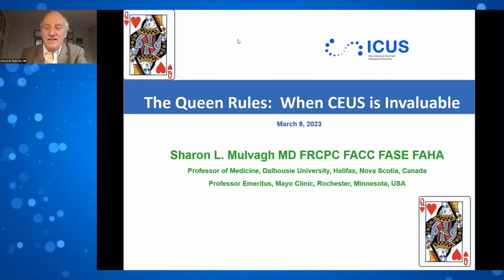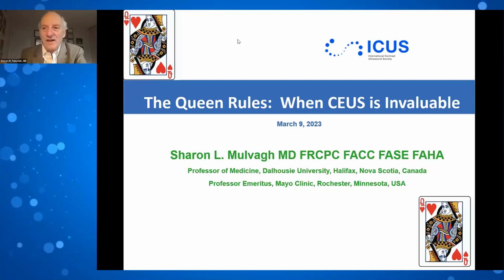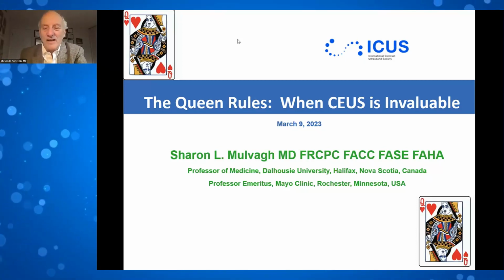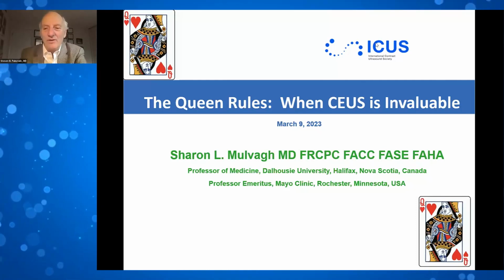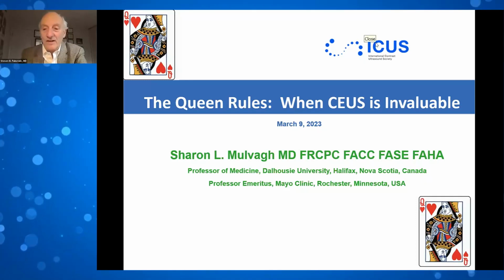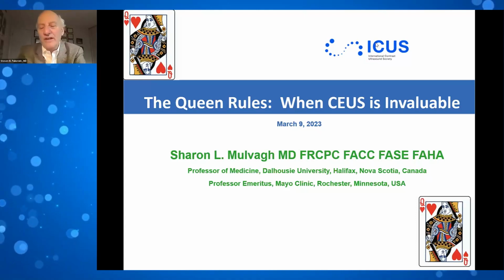And let me just say that I see the list of attendees, and I would encourage the attendees to participate and let us know, and your colleagues here, how many of you are using contrast on a regular basis. That would be fascinating for us, and on what indications.